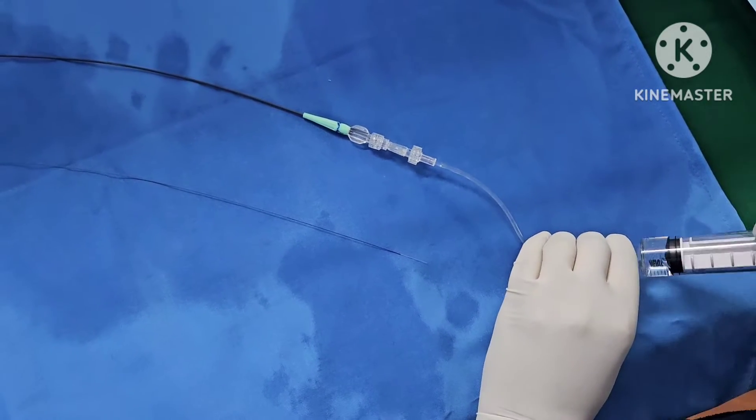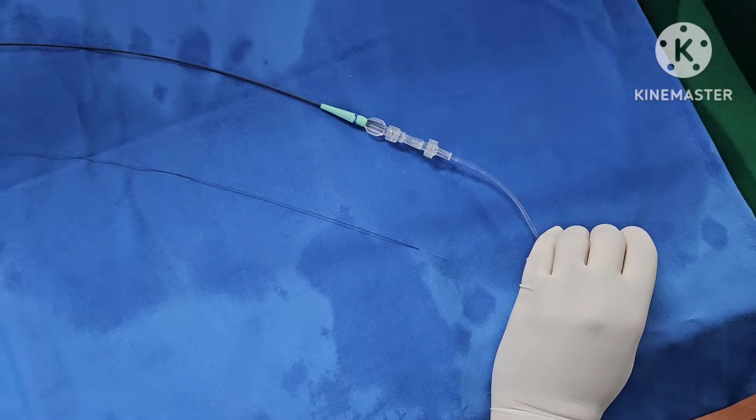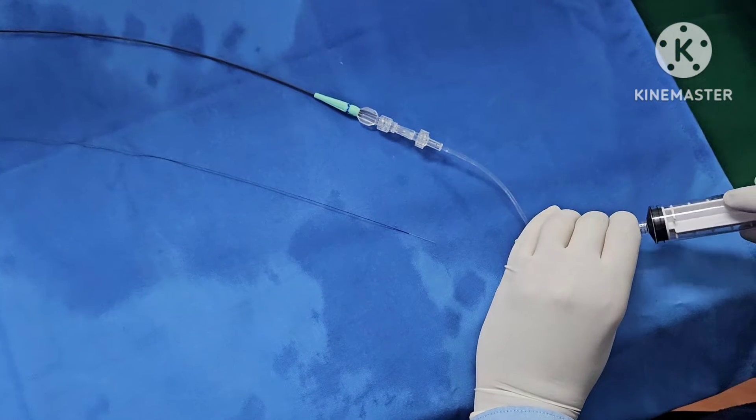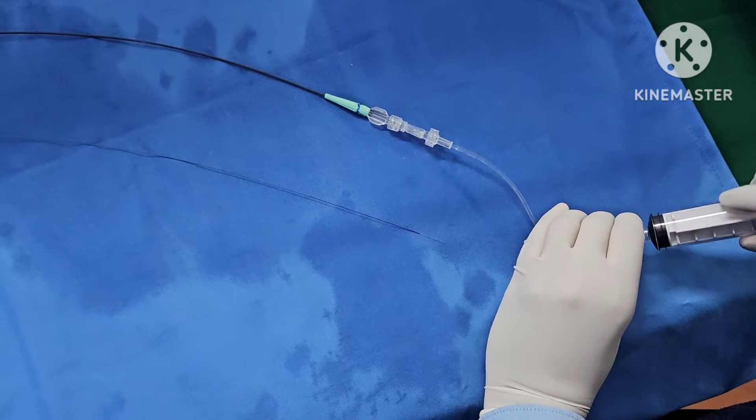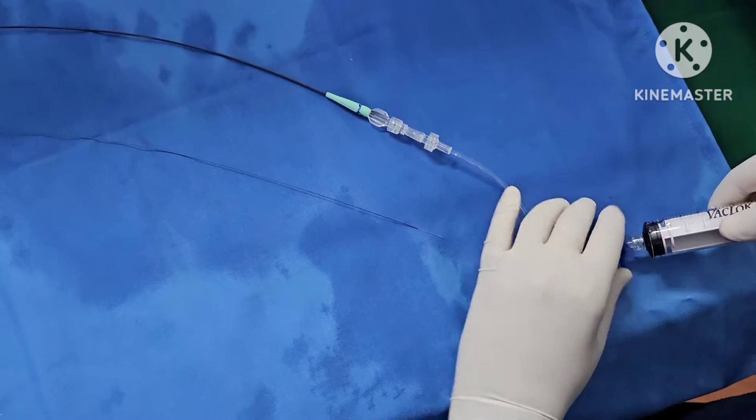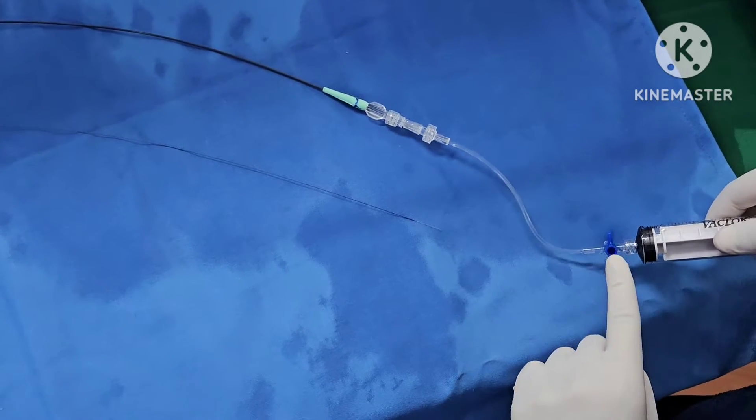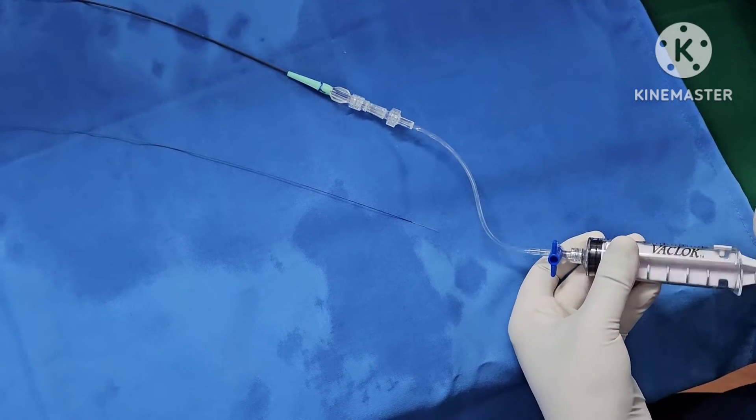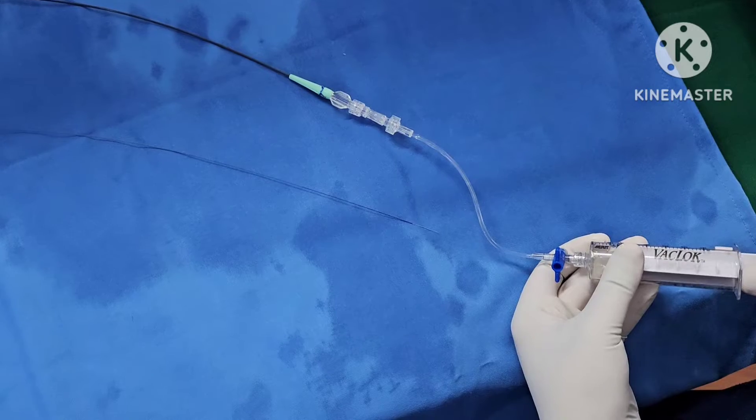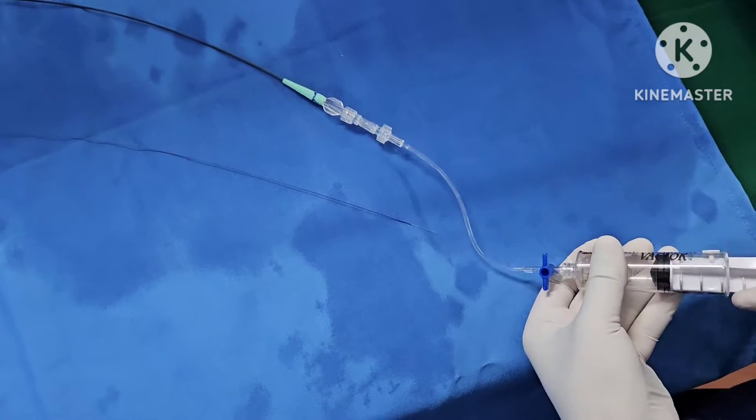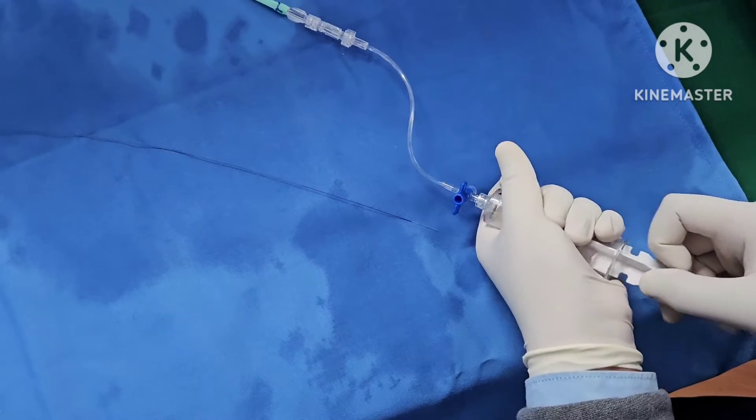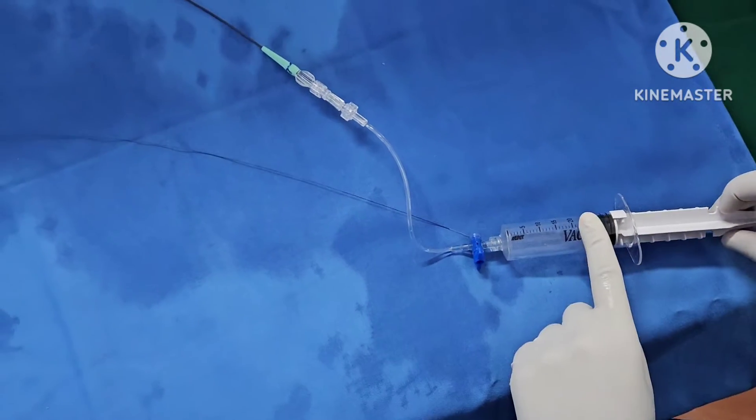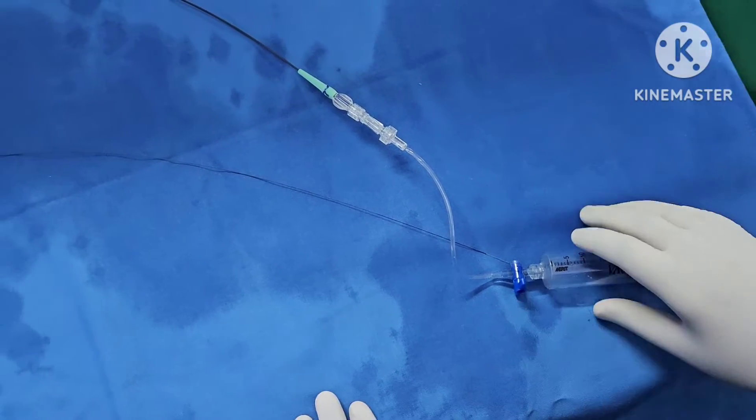And we will flush this whole thing keeping the stopcock open like so. After that, just for the sake of demonstration, we will take a syringe, this thrombus aspiration syringe, and we will put the stopcock to close and we will put it on negative pressure like so. Takes a lot of effort and already done that.